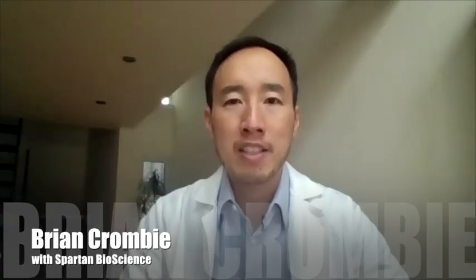So there's this drug, it's called Plavix. It's the number two best-selling drug after Lipitor. And it's commonly given to cardiac stent patients. So we have this test that cardiologists use to figure out, are you one of the people that Plavix will actually work for, or should you get different drugs? Right. And then what else? You've got another one you said for, was it Legionnaire's disease? That's right. It's for Legionella bacterial contamination of water systems. So for example, the air conditioning system of large office buildings can get contaminated with those Legionella bacteria. And the water vapor that comes off in the building, if you breathe it in, you can get Legionnaire's disease.